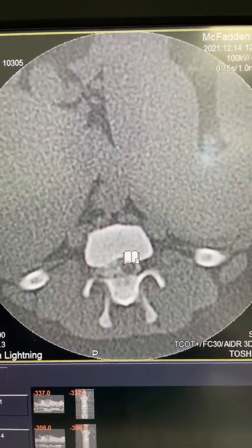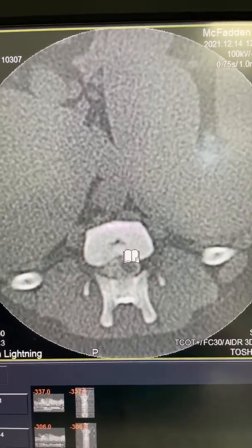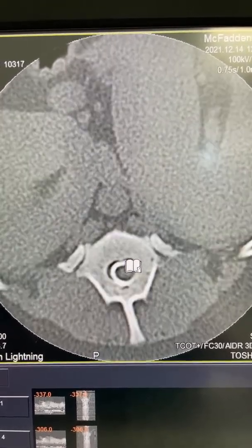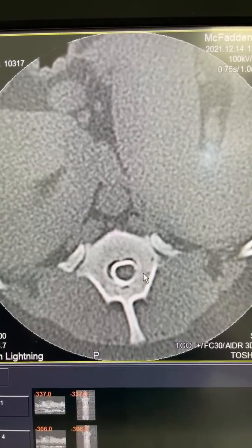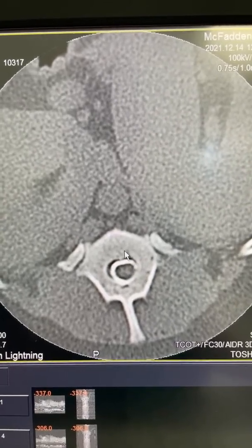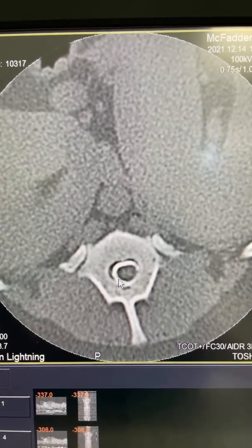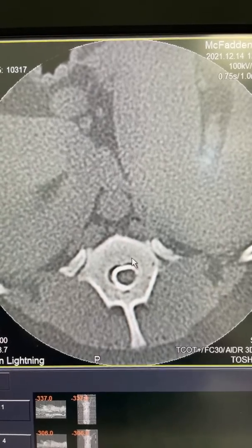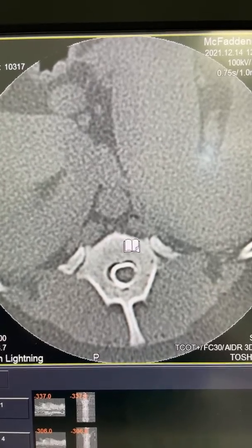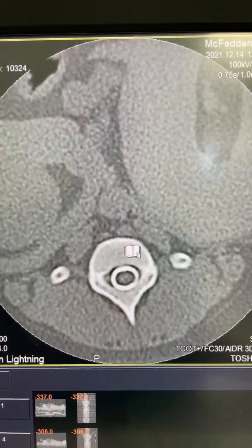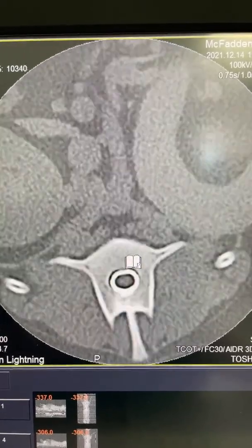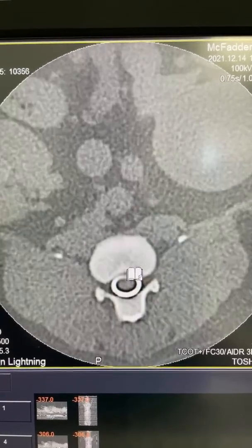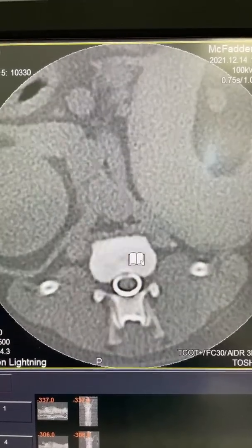More disc material there, and then as we head down further caudal we re-establish that entire circumferential contrast column, and so that's caudal to the compression — so that's all good there.